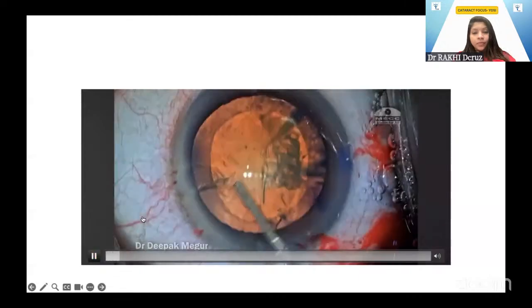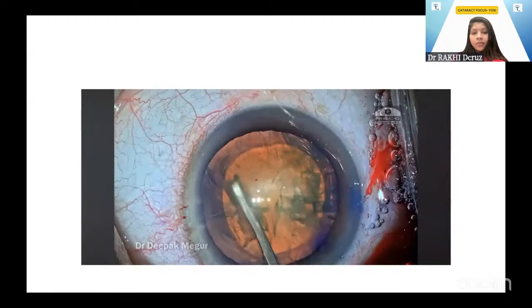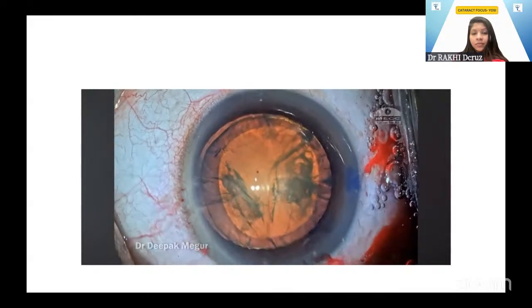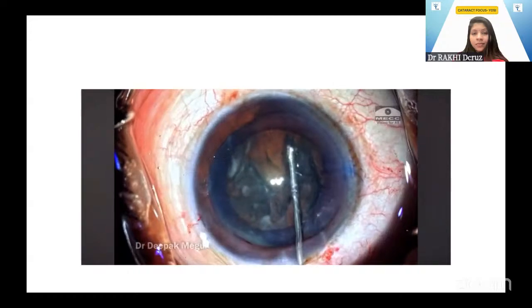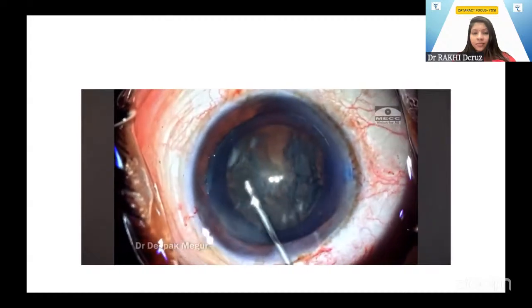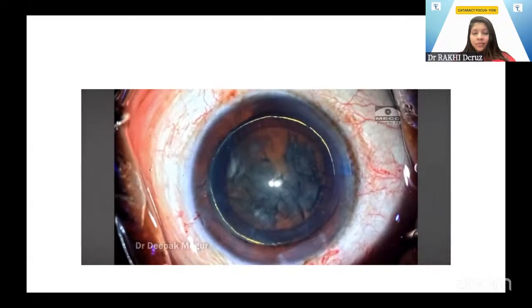You go ahead and press the cannula into the substance of the nucleus. Usually I prefer to do it at the edge of the rhexis, which is usually the size of the endonucleus. You press the fluid and you see this golden ring. The same step is demonstrated in the second case. You place the cannula into the substance of the nucleus, inject fluid, and you have this golden ring. This ring indicates the demarcation between the endonucleus and the epinucleus.